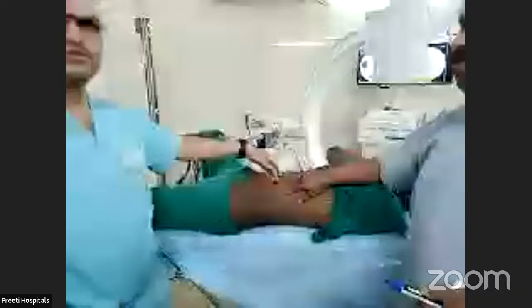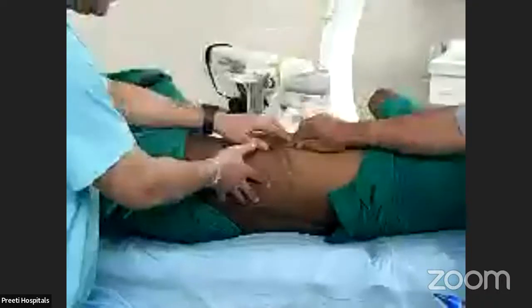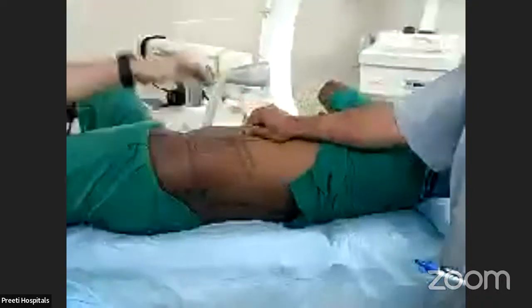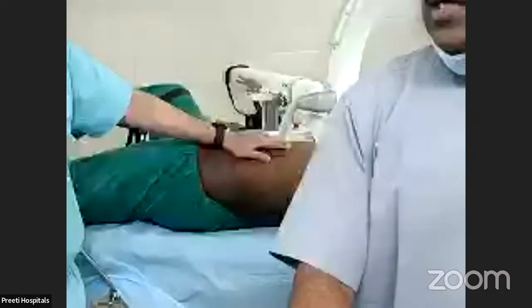But coming to the supine position, the superior pole of the kidney is posterior. So what do you have to do? We have to tilt the patient a little more like this. Then what is the disadvantage in supine PCNL? Spine interposition. So here you will be supracostal. Also you will be supracostal. Here you directly go to the posterior calyx with a minimum track. Here you have to go lateral with a little bit of a longer track. Here you will attack the posterior-most part of the calyx.